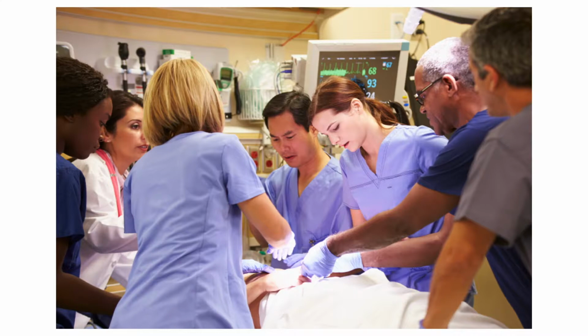Normally putting the tube in is straightforward, but it's actually watching the hemodynamics while the tube is being put in after the induction agent has been given, because that's the time these children deteriorate and arrest. And if people are watching you going, I hope they get the tube in, rather than watching the patient and their hemodynamics and optimising that, this is when mistakes can happen.